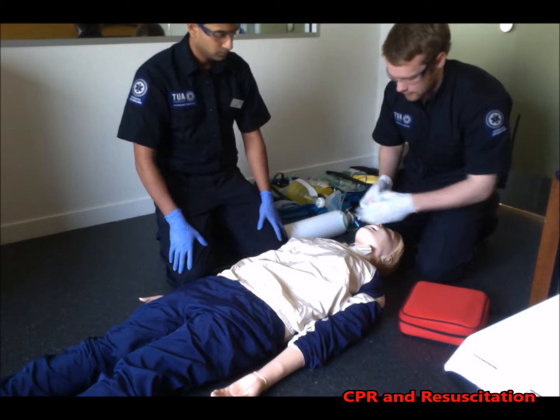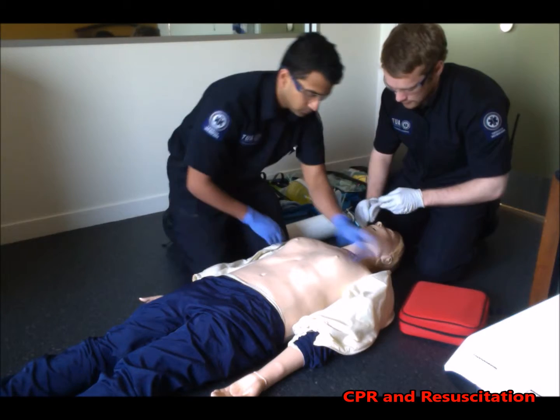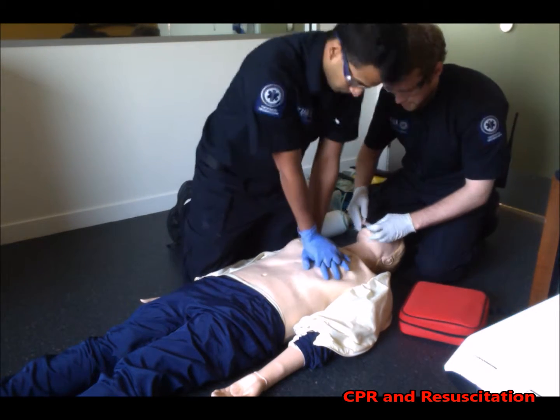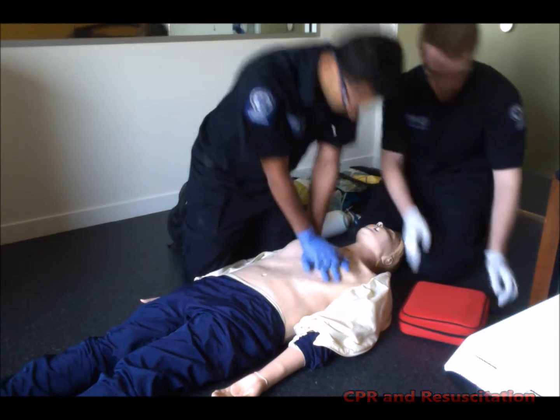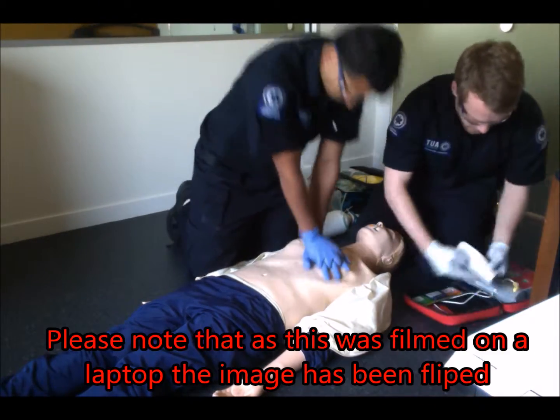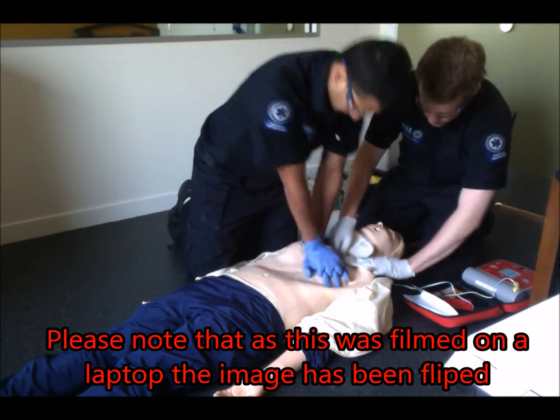So Dave, can I get you to remove any of the restricted clothing and start compressions? Doing sets of 30 compressions. So I've inserted the OPA. Next I want to get the defib ready. Placing these strips on where it's indicated.